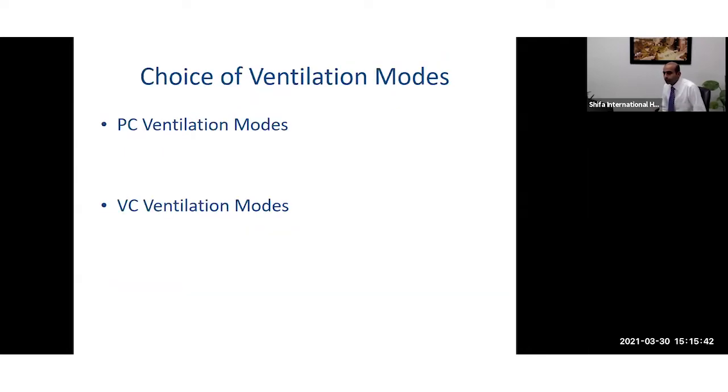So as we speak, we have two choices in terms of the ventilation modes. We have pressure control ventilation modes and we have volume control ventilation modes. And I think as clinicians looking after babies on the ventilator, it's very important that we understand these ventilation modes very clearly, and in our heads, we are very clear how these two modes work, because the ventilation strategies, the weaning strategies for both modes and the initial starting settings are very different.